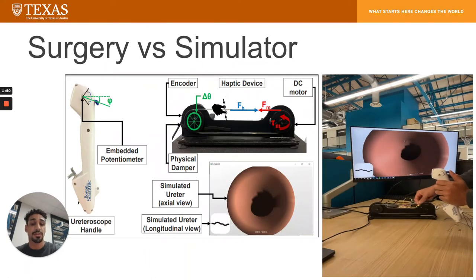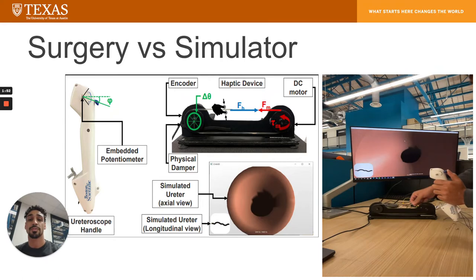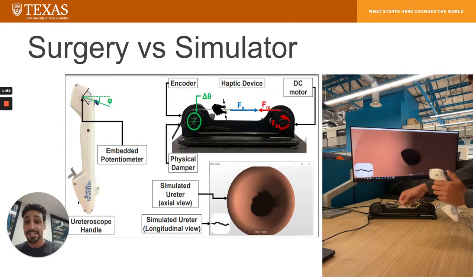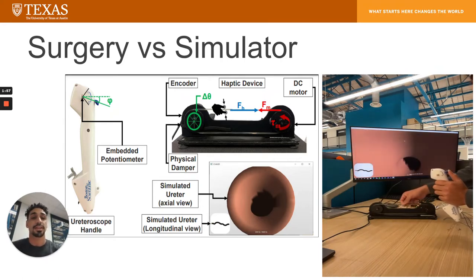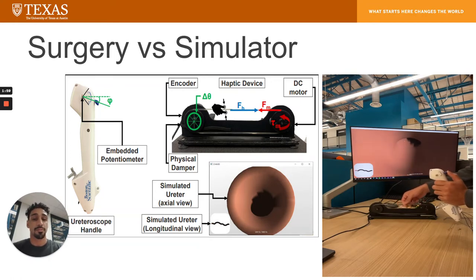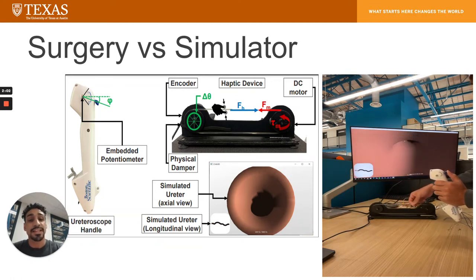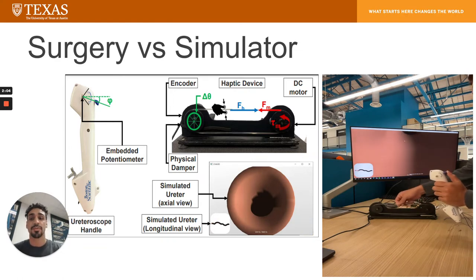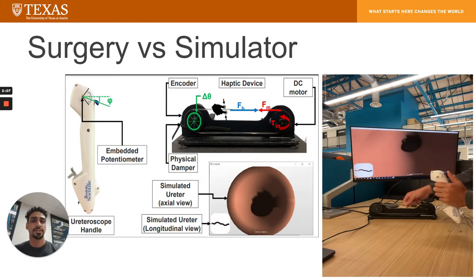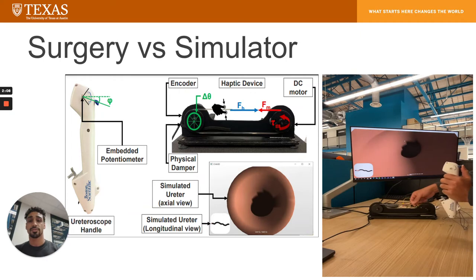In comparison, the user can move the tip of the ureteroscope in the virtual world by pushing and pulling on an elastic band that rotates a simple pulley system, and rotating the dial on the sensorized ureteroscope handle to change the orientation in the virtual world. A DC motor attached to one of the pulleys provides force feedback during collision of the virtual tip of the ureteroscope and the virtual ureter.